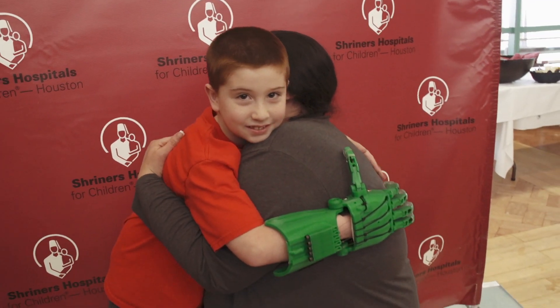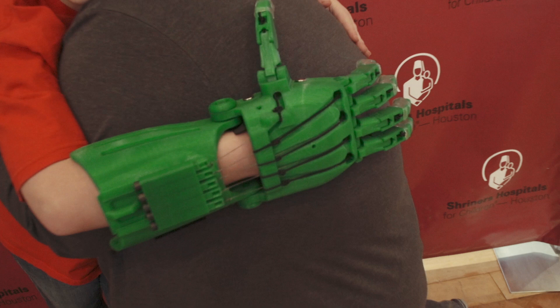One of the great things about today is kids are not just getting fully assembled hands — they're building the hand themselves. They got the parts, they got the instructions, and they're learning how to build it together with their parents.